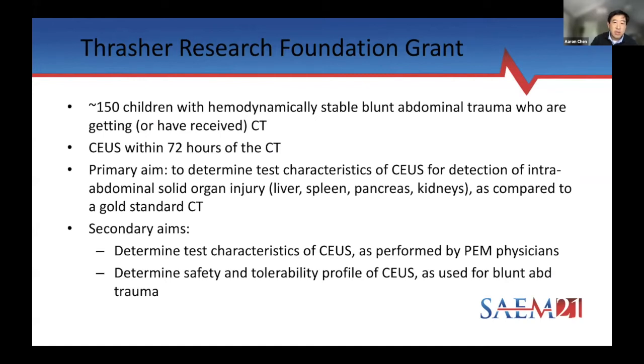This is our study that was funded by a generous grant from the Thrasher Research Foundation. We're trying to enroll about 150 children with hemodynamically stable blunt abdominal trauma who have received or are planning to get a CT scan. And then we do the CEUS, or contrast exam, within 72 hours of the CT.